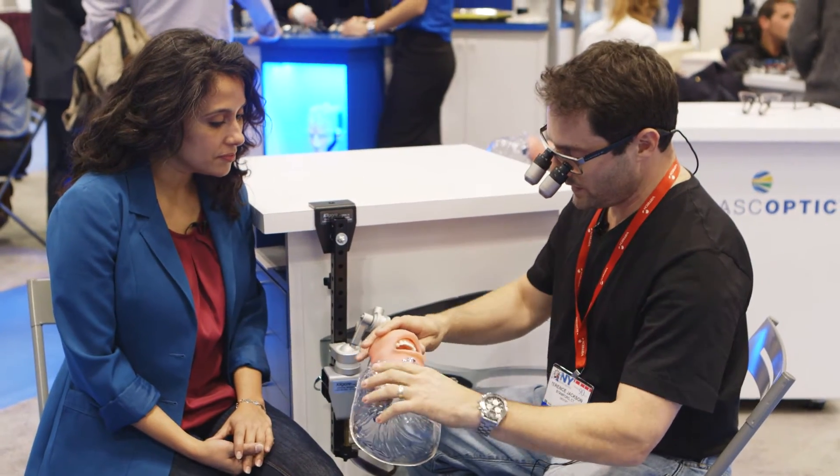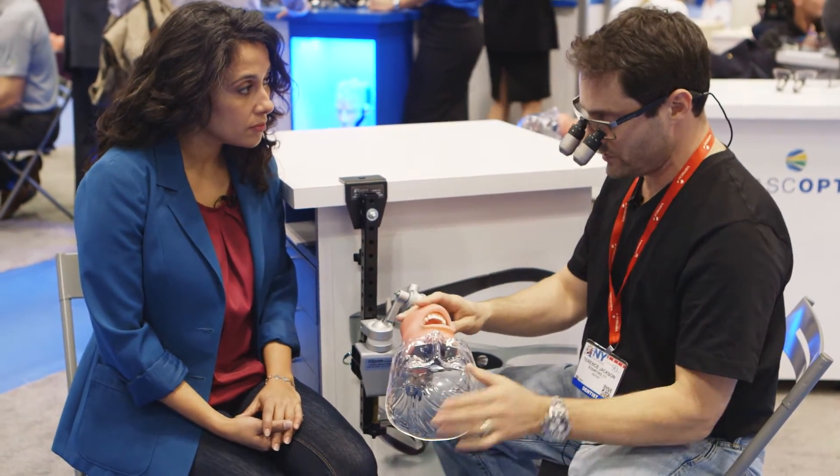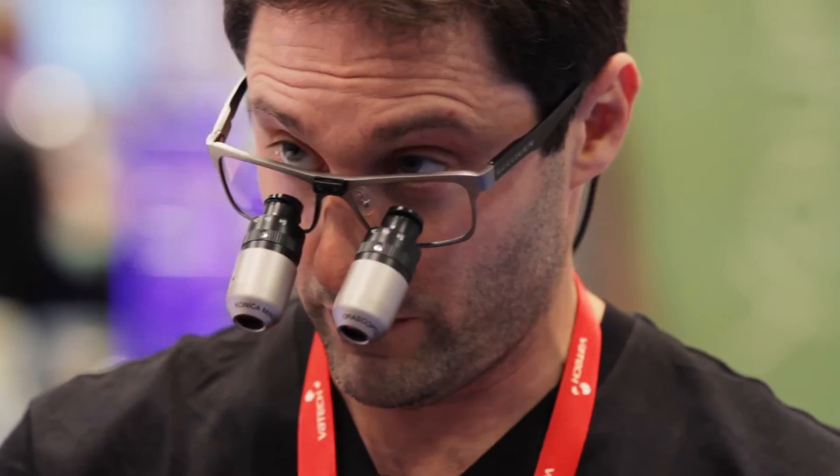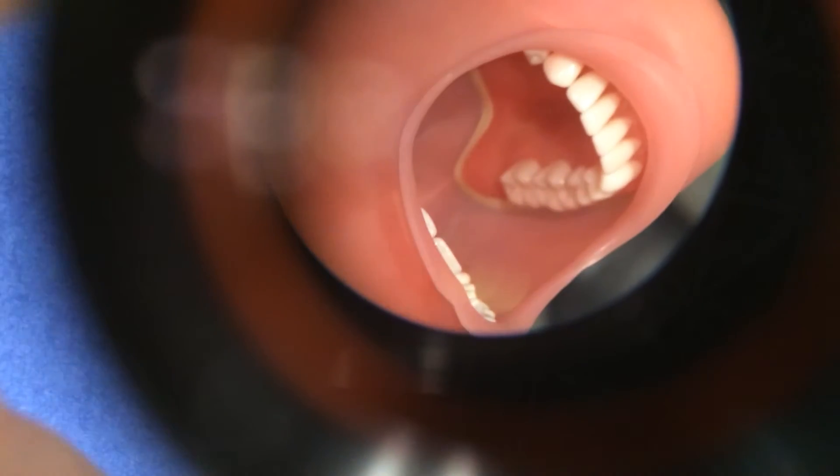When I typically do guided tissue regeneration, I'll usually use my magnification at 3.8x. I'd get up and get my other glasses, but these actually have a 5x built in so I can get even closer.